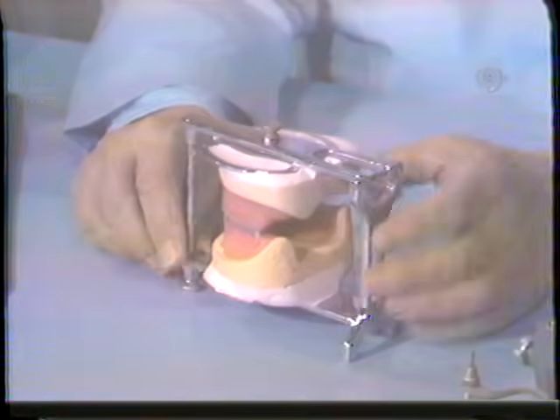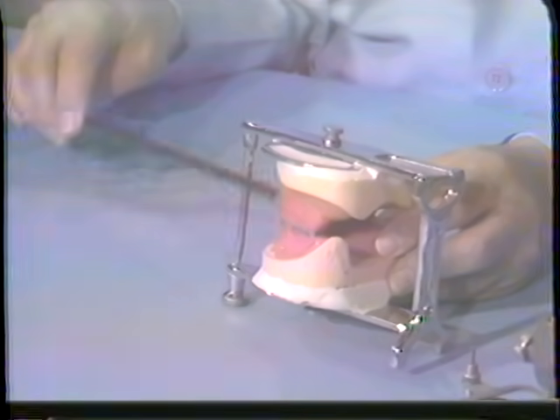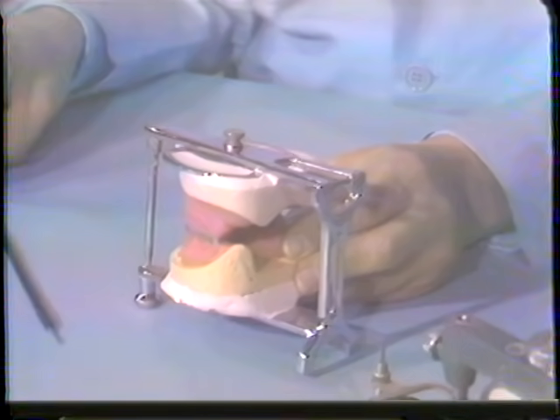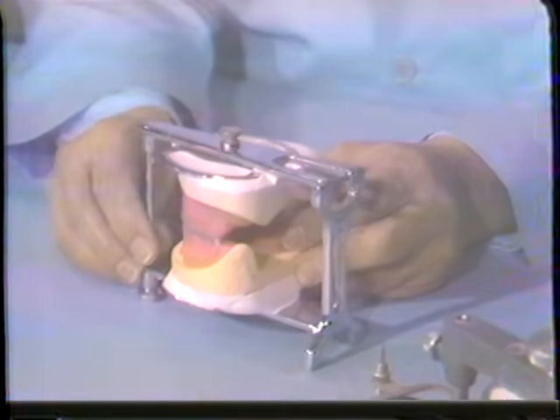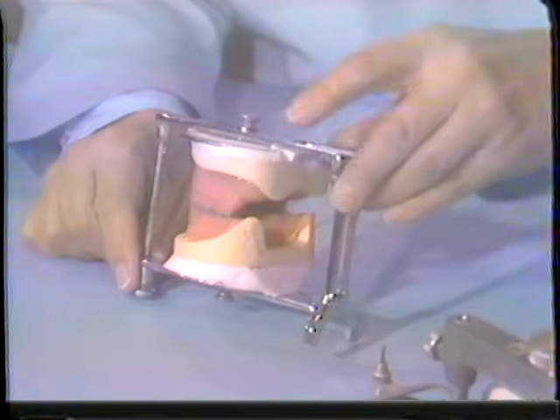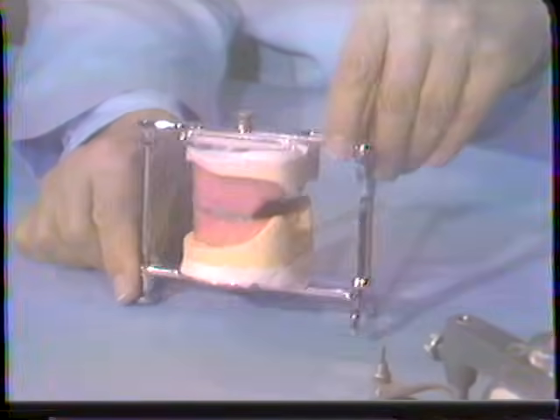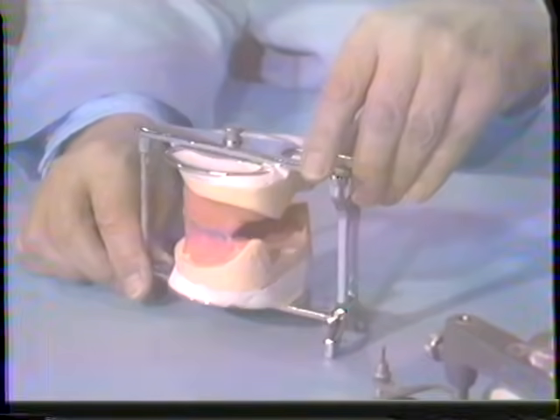Now, without a facebow transfer, we should not ever change the vertical dimension of occlusion. As long as we're working within this recorded position, setting the teeth, later on checking out the case, which is rather difficult to do without changing the occlusal vertical dimension. But we cannot change the occlusal vertical dimension because we have not made a facebow transfer on these instruments up to now. These are simple holding instruments, holding a centric relation at a recorded occlusal vertical dimension, and that's all they're capable of doing.